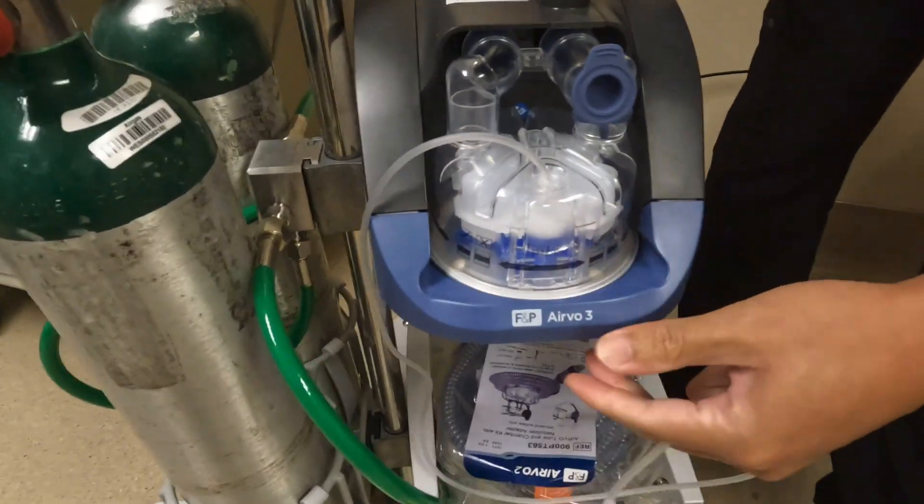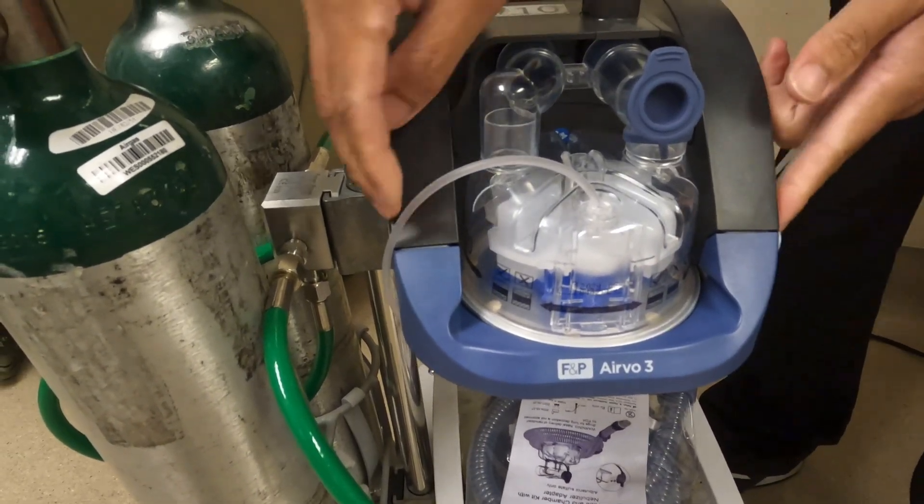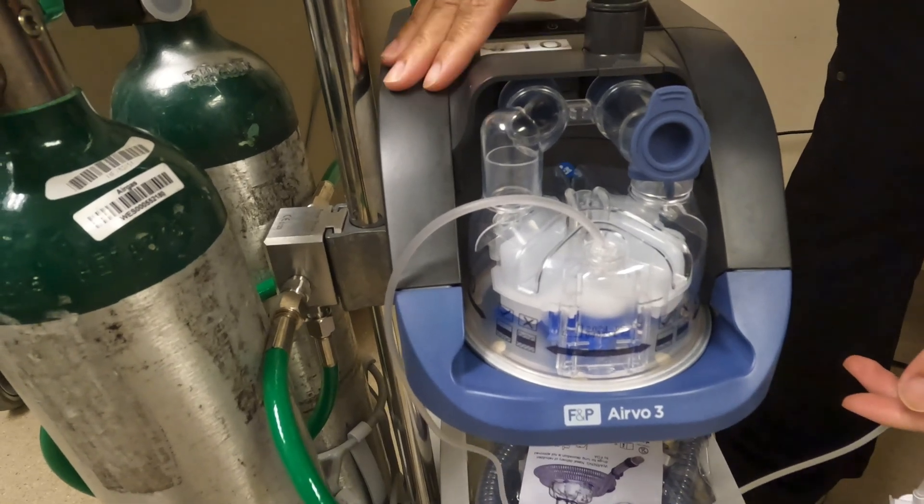This push plate right here should also make a click. If it raises up and it's leveled with its edges like so, then it's connected correctly.